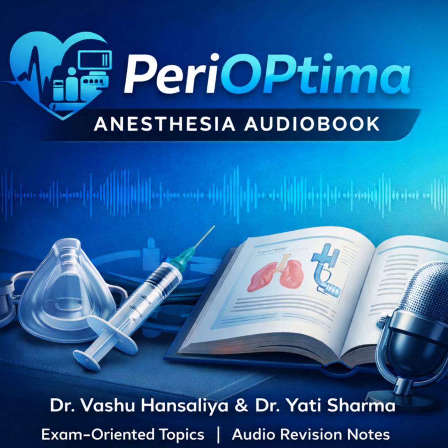Capnography is the continuous measurement of CO2 in exhaled gas. And its primary, absolute gold standard indication: confirmation of endotracheal tube placement. If you don't see that square wave, the tube is not in the trachea. Right. Or the patient's in cardiac arrest. No trace, wrong place. It is more reliable than listening to the chest.